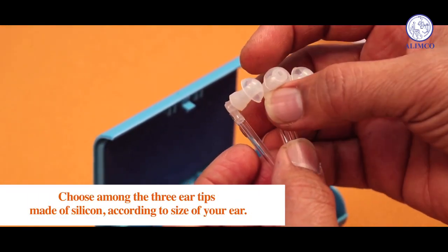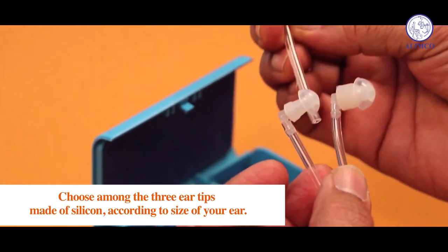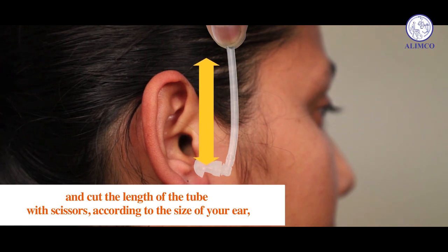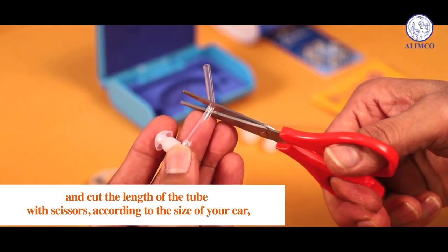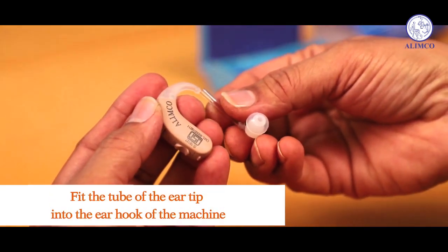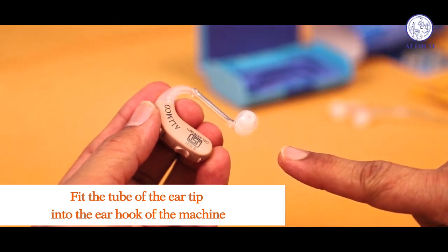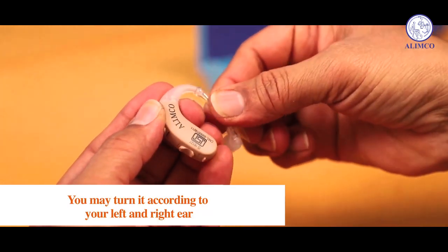Choose among the three ear tips made of silicon according to the size of your ear, and cut the length of the tube with scissors according to the size of your ear. Fit the tube of the ear tip into the ear hook of the machine. You may turn it around for your left or right ear.